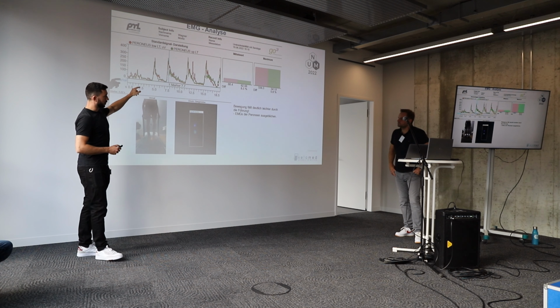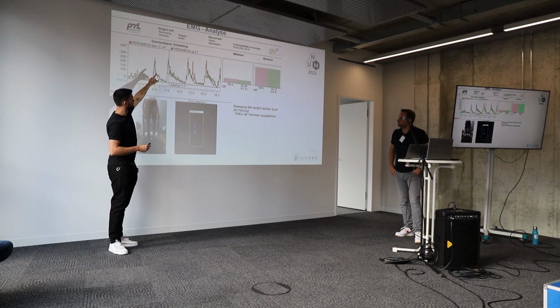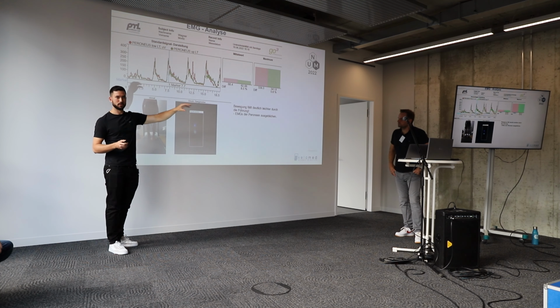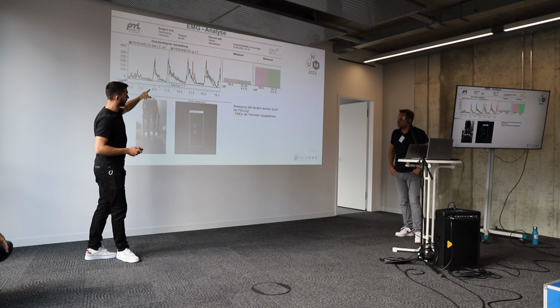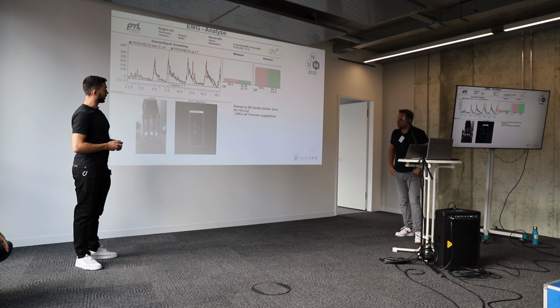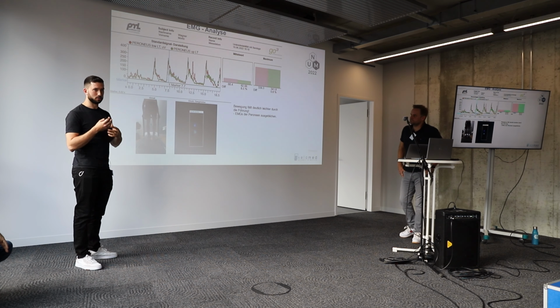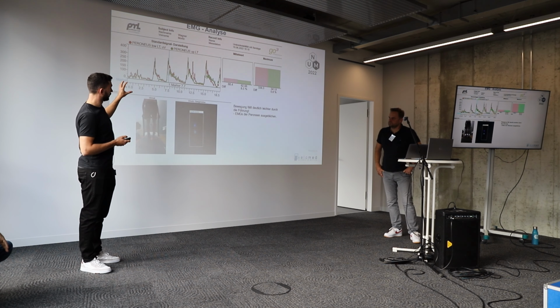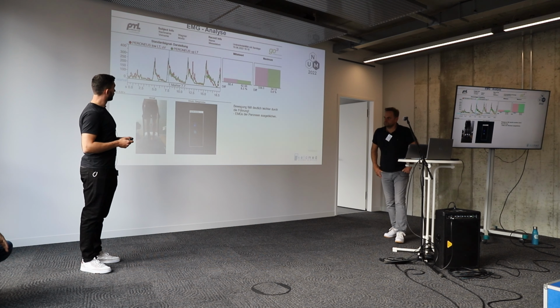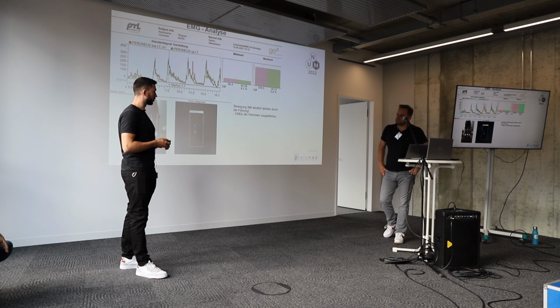And that was the same day, 5 minutes later, with a bandage. And you see there's, like on the right side, upper to lower peroneus muscle, and there's no difference anymore. So it must be some kind of motion control, feeling secure, whatever. Yeah, so the task was how to get this muscle fixed, how to activate it the way it should.